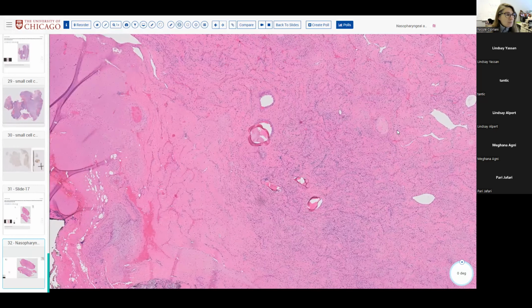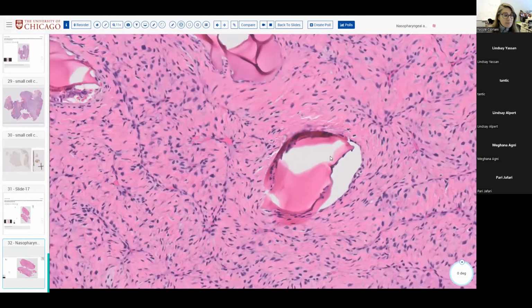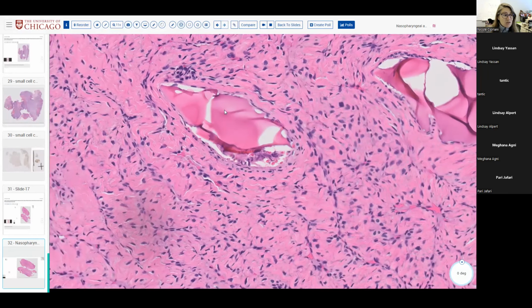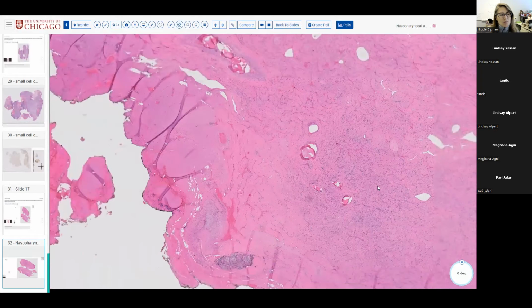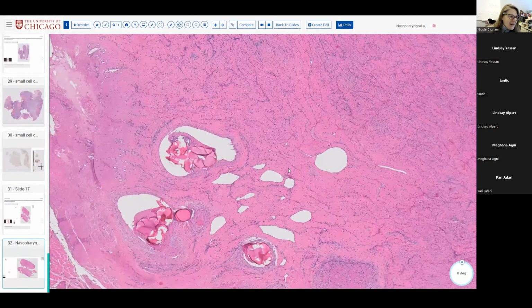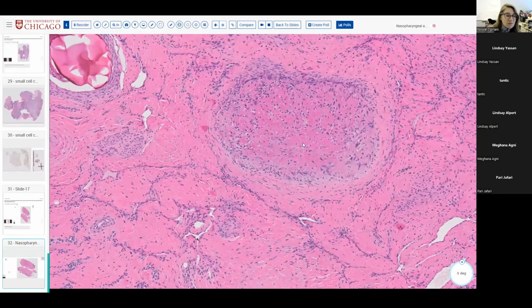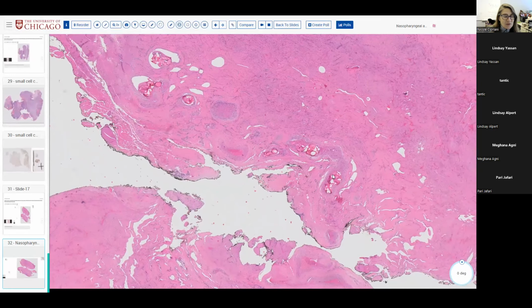So these kids generally present with nosebleeds, and one of the things that happens preoperatively is they undergo embolization, so sometimes you can actually see this amorphous eosinophilic embolic bead material in the vessels. You may assume that they underwent embolization, but in this case you could actually see it, and it resulted in maybe a little bit of downstream degenerative change or necrosis. If you said that you saw the embolic beads, that was your bonus point.